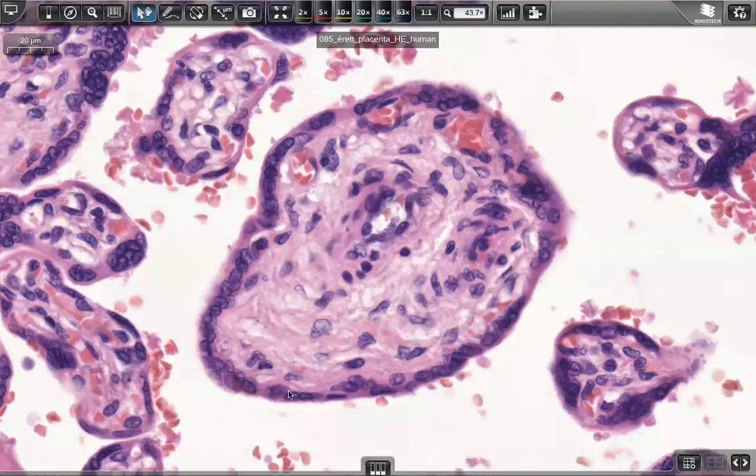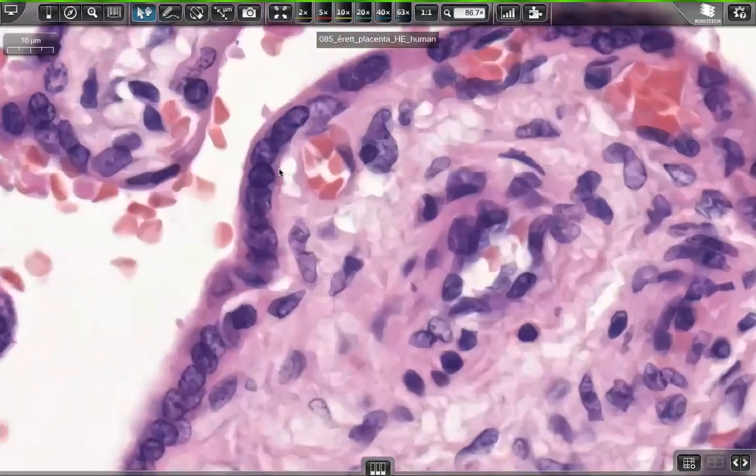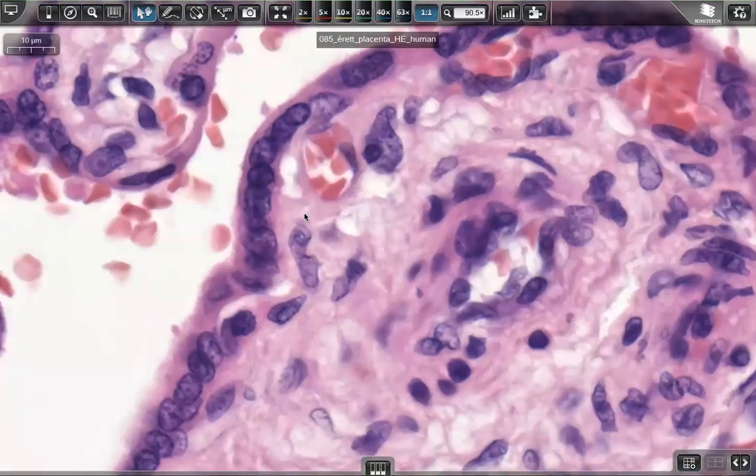The cytotrophoblast is reduced at the end of the 4th month. In some villi, maybe some remnants of the cytotrophoblast cells are present, but mainly syncytiotrophoblasts are covering the villi. Underneath them we have a lamina basalis, and there is a mesenchymal core.